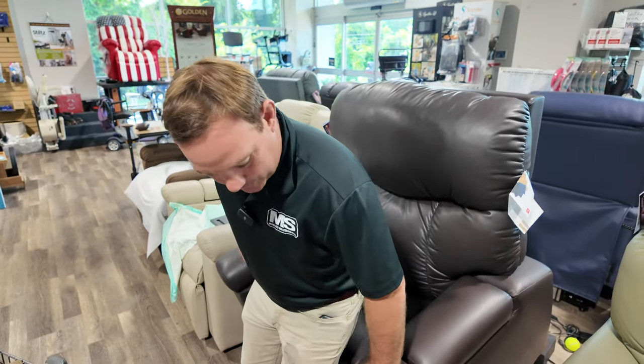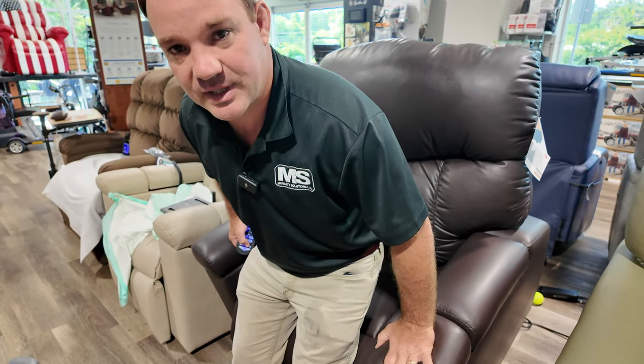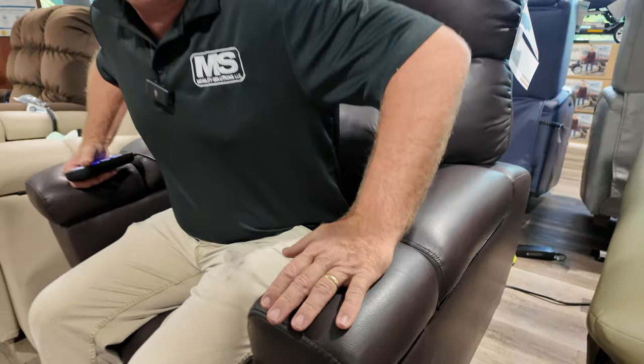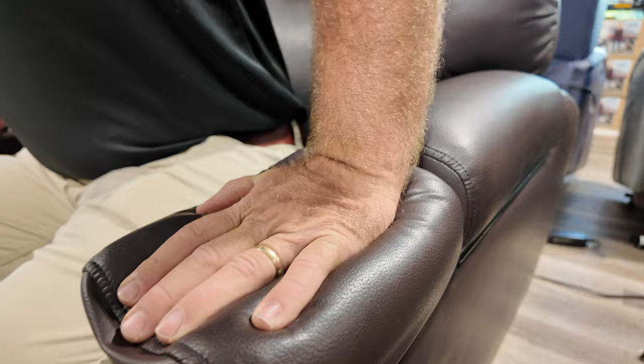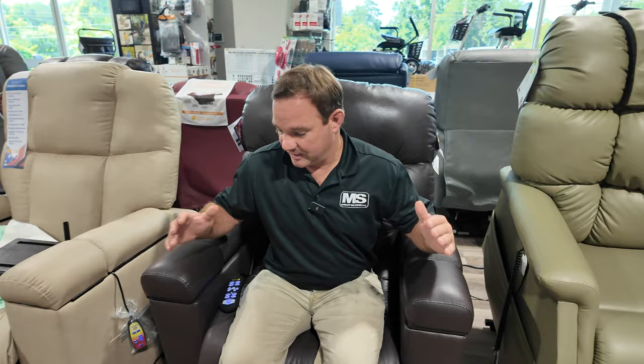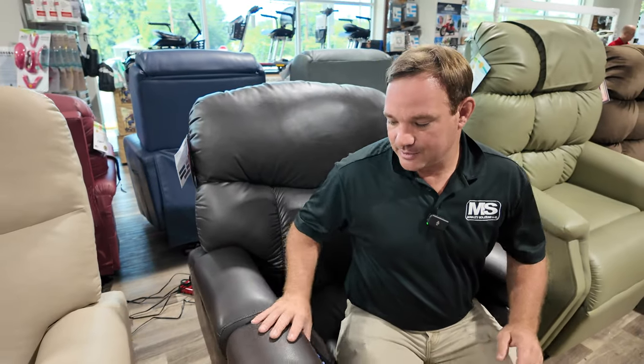The arms are cushiony but not so overstuffed that you can't push yourself up. Some chairs are more overstuffed, making it harder. If someone is having difficulty pushing themselves up, call us and we can go over whether a different arm might suit you better. Everyone needs and wants something different. We have many chairs here in different sizes, fabrics, and a couple of different manufacturers. We're a big Golden provider — we love Golden. Let's get into the accessories.